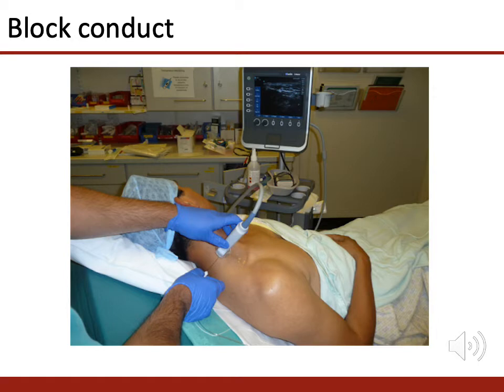This is an in-plane technique with the operator standing towards the head of the patient in line with the probe, which is then in line with the ultrasound machine.